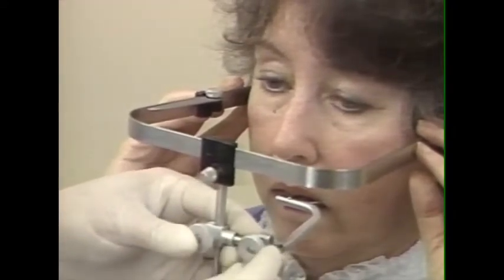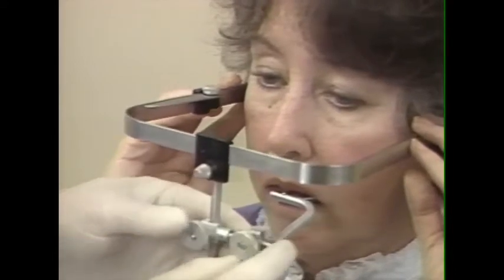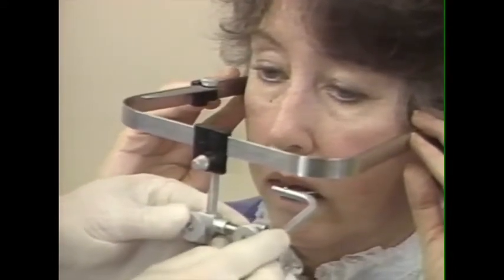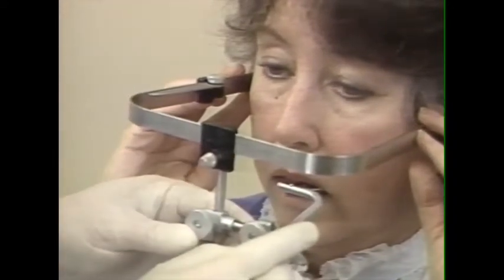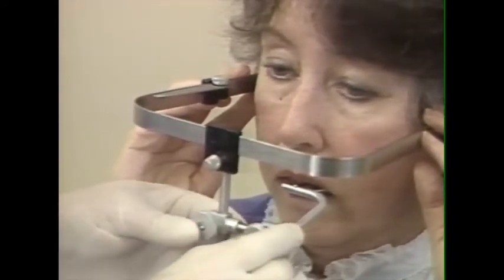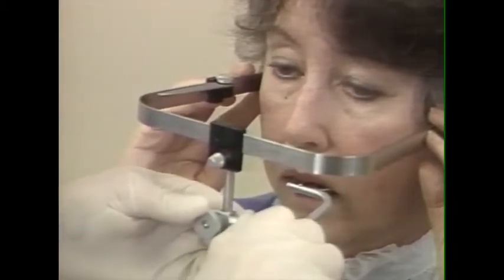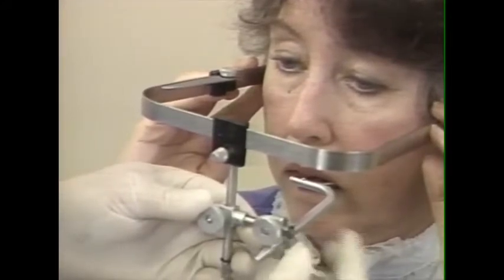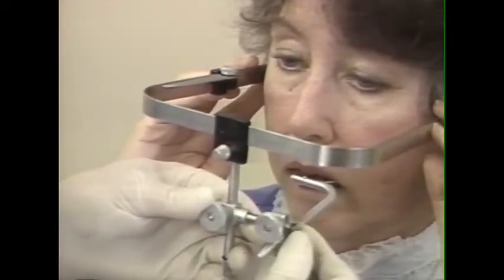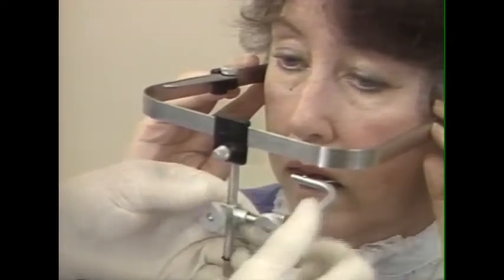We next want to be sure that the face bow is not in a bind and it's perfectly free. It can be pushed too far to one side so that we will not secure a correct record. We now tighten number 2 and then tighten number 3. Tighten them securely so that it won't slip.